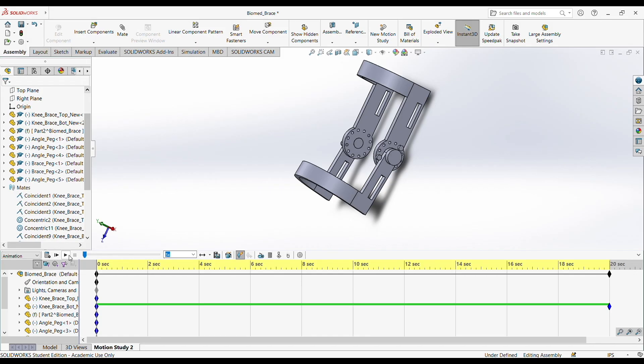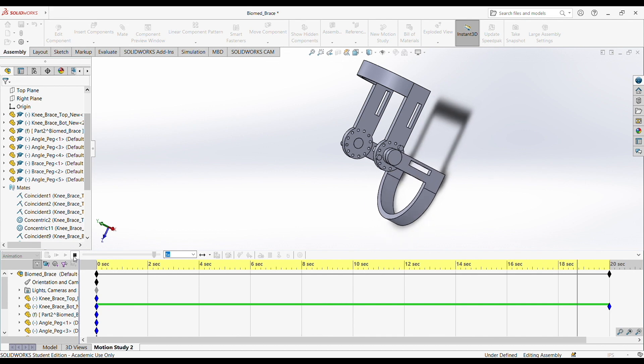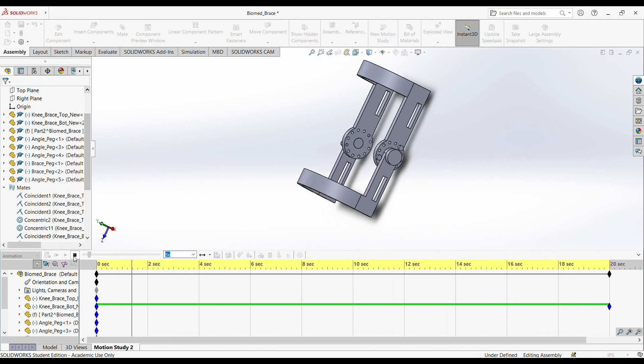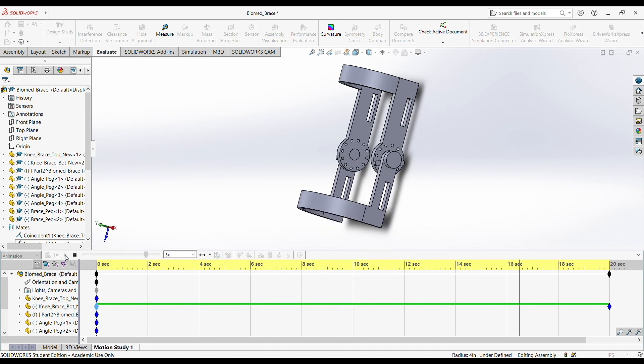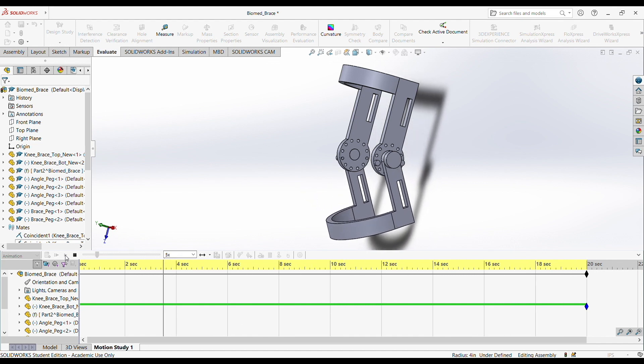This is an animation from SolidWorks of our design, showing a different pin setup. Any questions? Thank you.